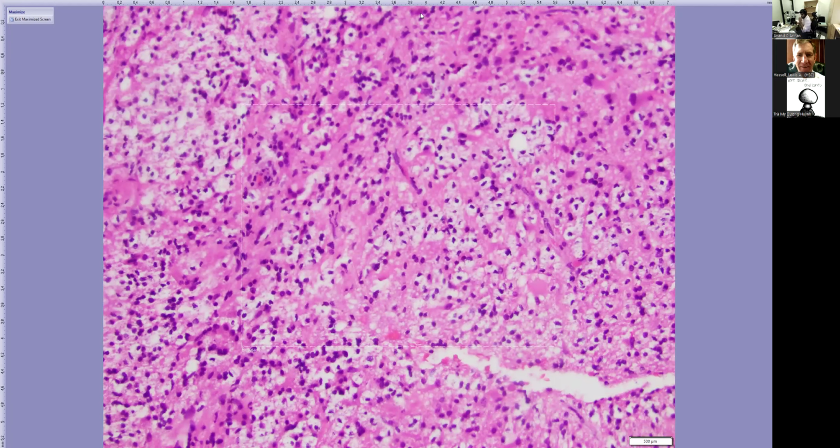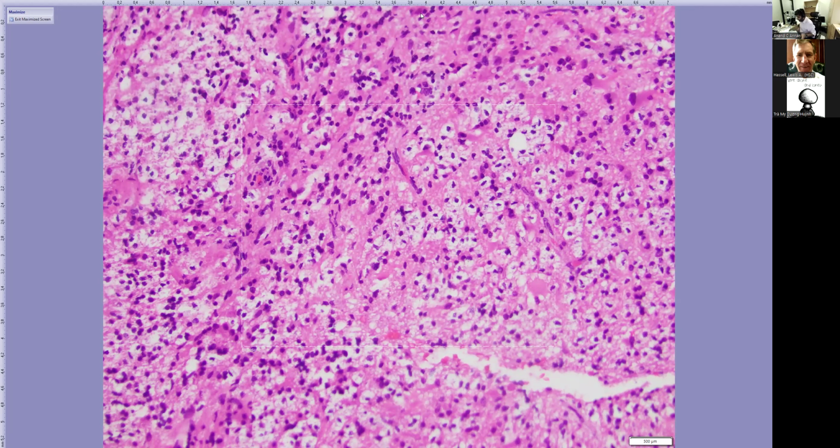So this was consistent with histiocytes, and we did markers like CD68 was diffusely positive in this lesion. So the only thing that we found was a macrophage-rich white matter lesion, and that is a non-specific entity. It doesn't mean anything. It could be suggestive of a demyelinating disorder, inflammatory demyelinating disorder.